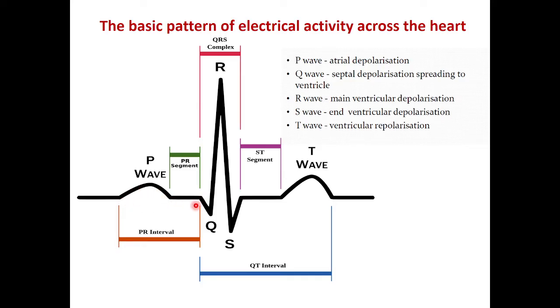It's mostly the period between what? Between the conduction of depolarization, of electrical activity, from the sinoatrial node to the AV node.